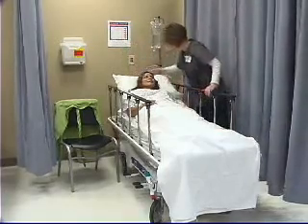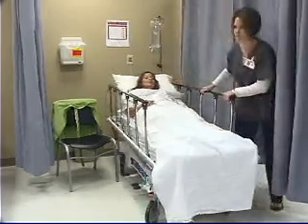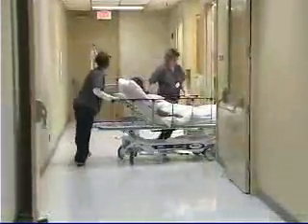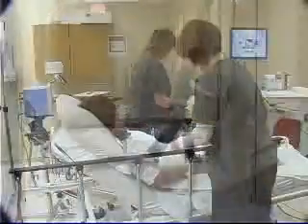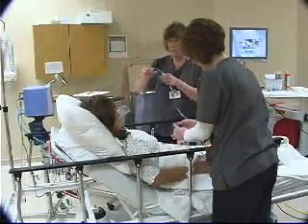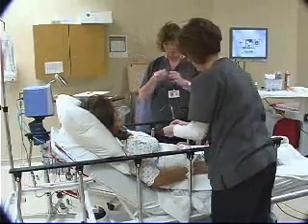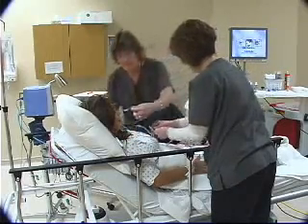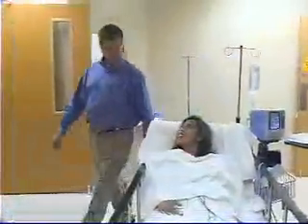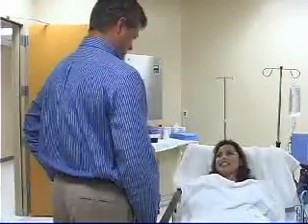Upon preparing for the procedure, the nursing staff assigned to you will take you by stretcher to the procedure room. Your family or friend will be shown to the waiting room to wait while you are in the procedure. Monitors will be placed on you in order that we may take your blood pressure, heart rate, and oxygen saturation. You will be placed on a small amount of oxygen through a nasal cannula. Next, your physician will greet you in the room and may ask questions. He will also answer any questions that you may have.